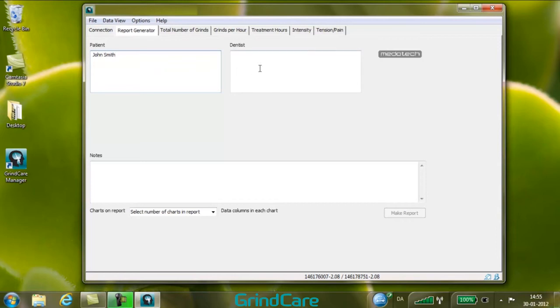Enter the name, address, phone number and other dentist and clinic information to be printed on the report. The data is saved in GrindCare Manager and is available for all subsequent patient reports.